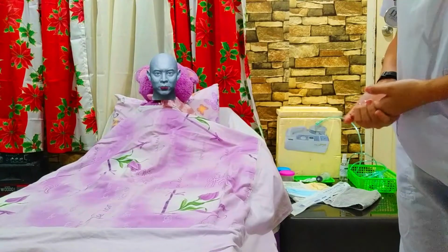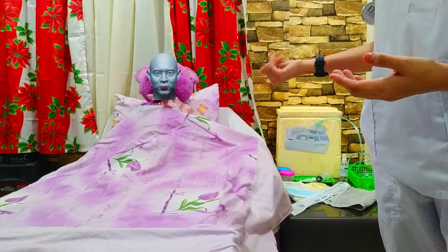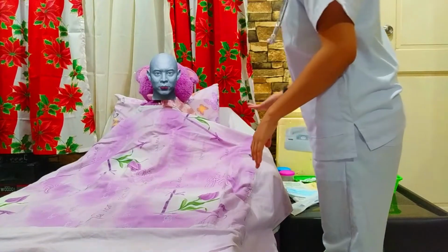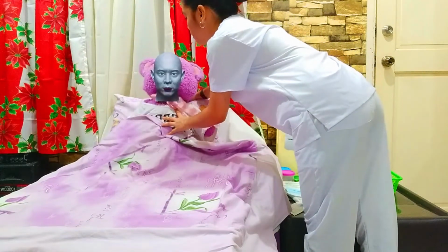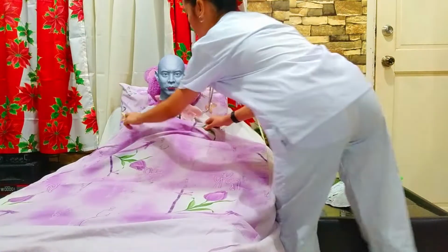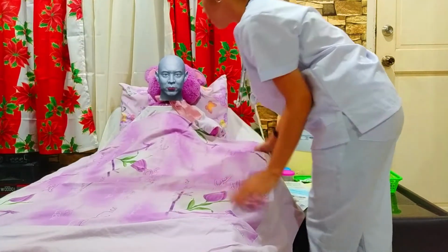And then we need to position the patient, and as you can see, my patient is conscious, and I'm going to position him in a semi-Fowler's position. Okay, sir? You're comfortable?